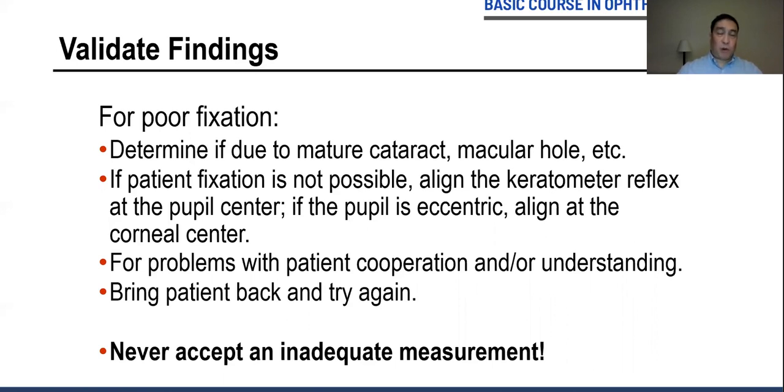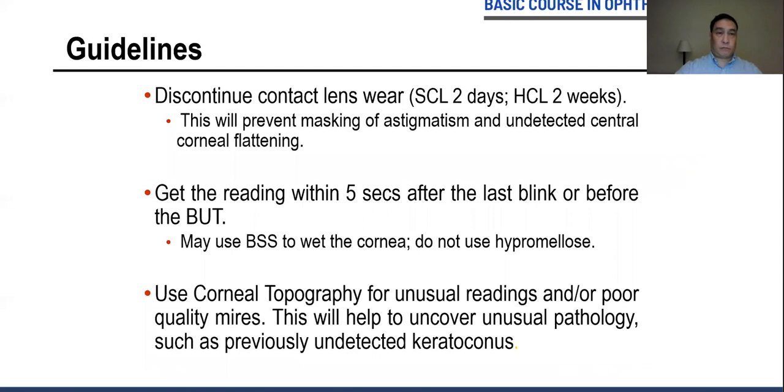That's why it's important that all of you learn how to get the measurements for all the machines you're going to use, because at the end of the day, you're responsible for your patients. Never rely on what the technician gives you. Always make sure that it's an accurate measurement.